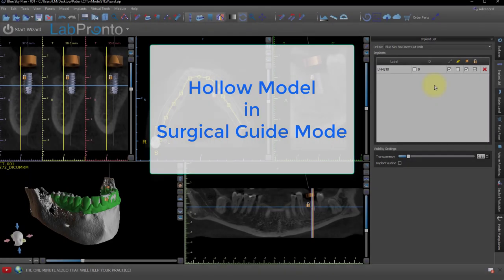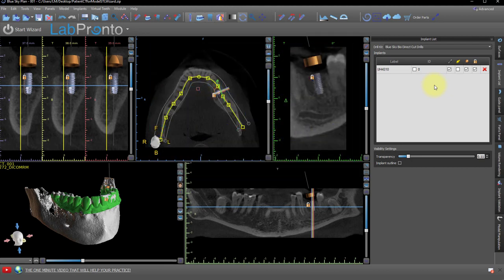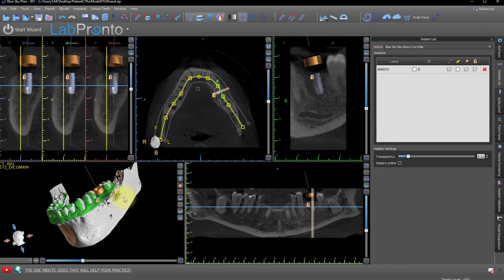To create a hollow model in the surgical guide module, first load the DICOMs, then import the model into the plan. I've already done that and aligned it, and as you can tell, also placed implants — all this to save time.